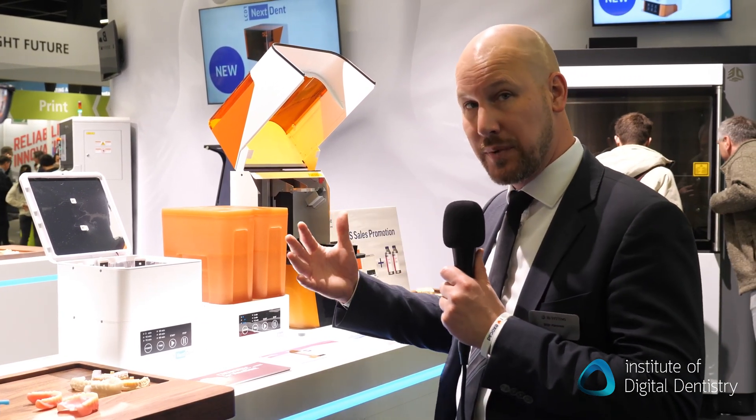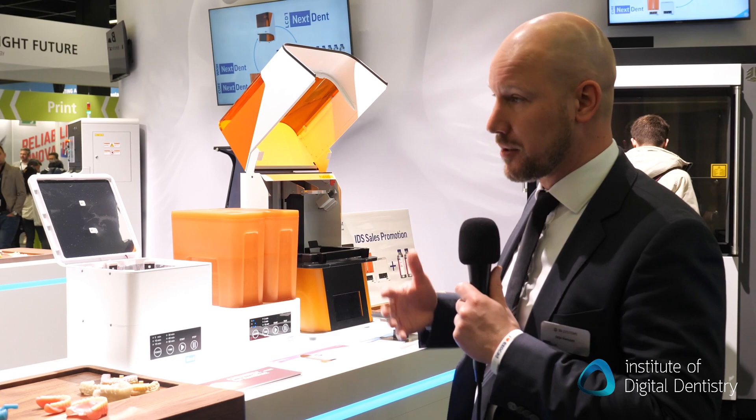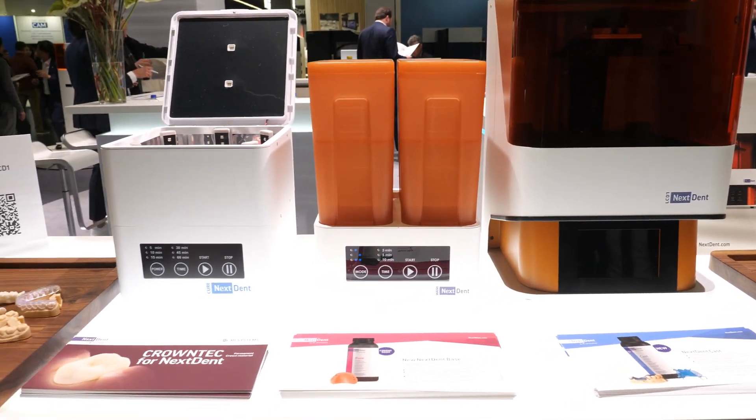It doesn't come with the speed that the 5100 has, but it covers the whole range of NextDent materials. It is also an open system, so you can use other materials as well, with a new two-container washing device and a small cure box.